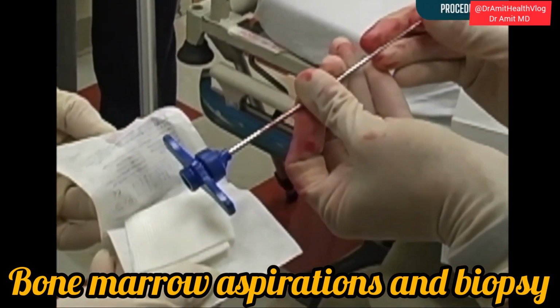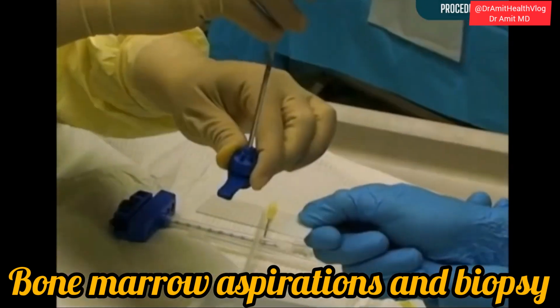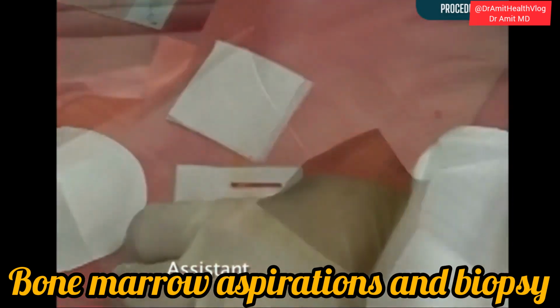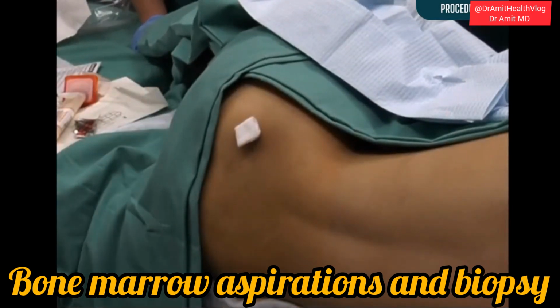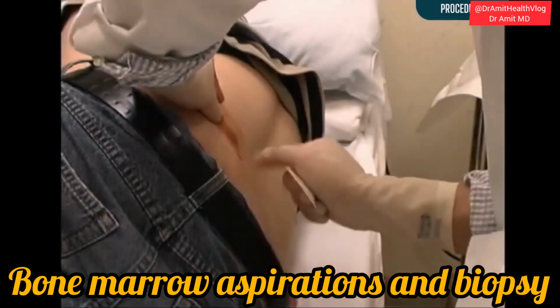Remove the specimen from the needle by inserting a sterile probe into the distal end of the needle and push the specimen through the hub onto sterile gauze or a slide. Inspect the specimen for adequacy of marrow. Apply pressure to the biopsy site with gauze until any bleeding stops, and cover with a bandage or pressure dressing. Instruct the patient that the dressing can be removed the next day, and that they should protect the wound from contact with water until a firm scab is formed.